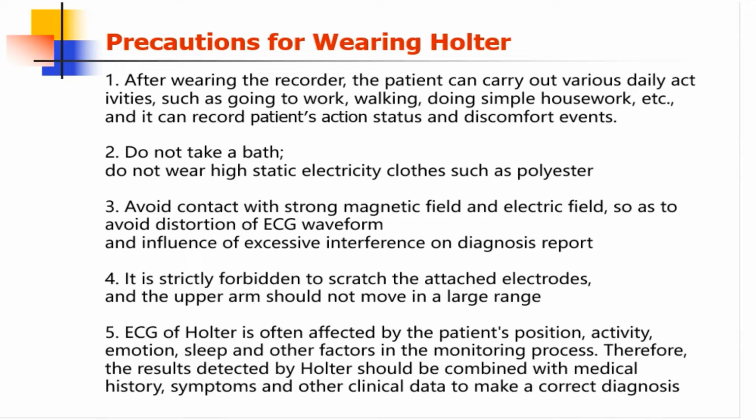Precautions for wearing Holter. After wearing the recorder, the patient can carry out various daily activities, such as going to work, walking, doing simple housework, etc., and can make life records and record discomfort events. Do not take a bath. Do not wear high static electricity clothes, such as polyester.